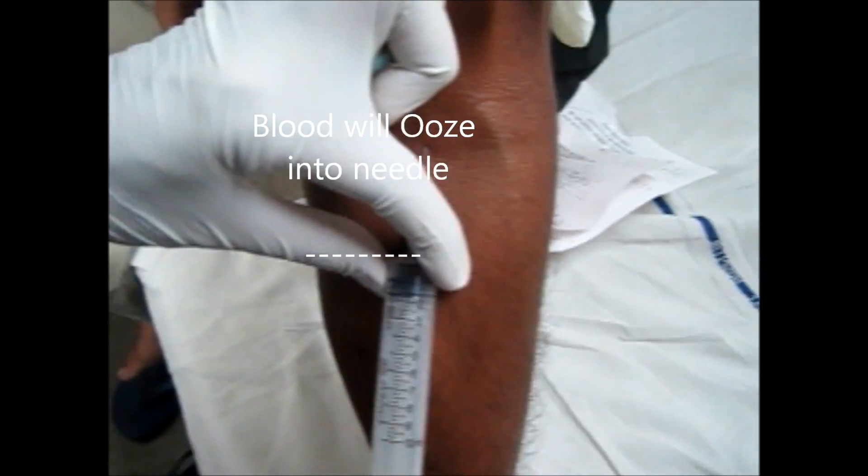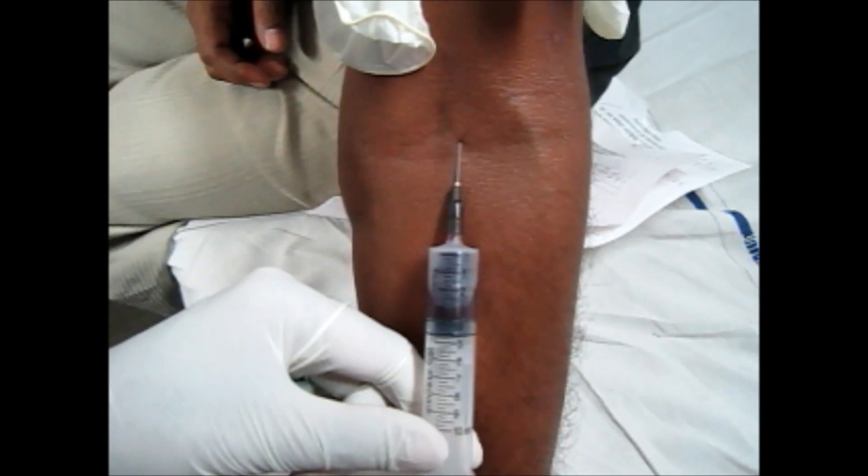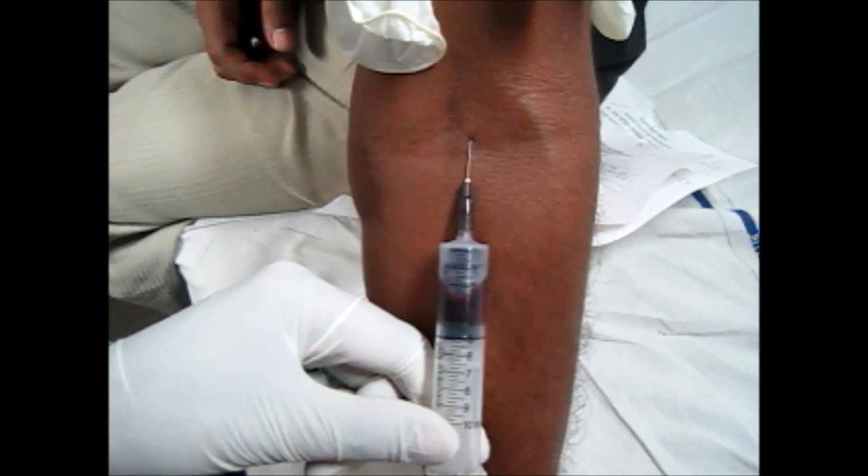After that, apply pressure so as to suck the required amount of blood. Now, remove the needle as shown in the video by placing the spirit swab.